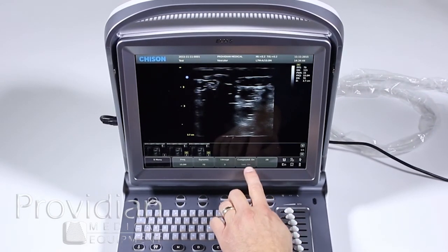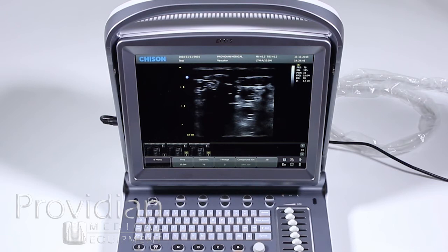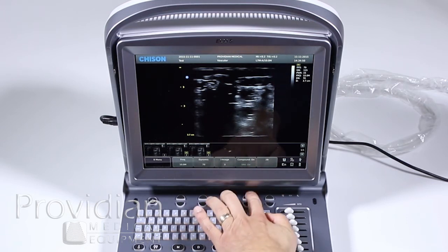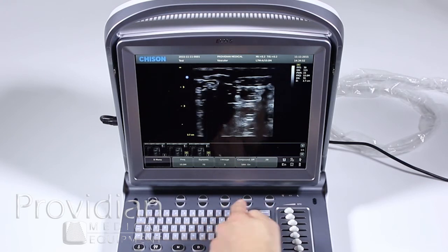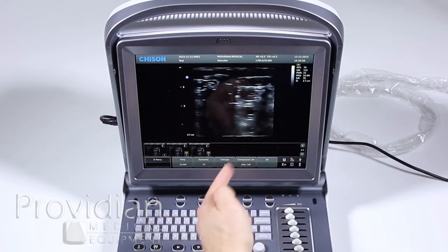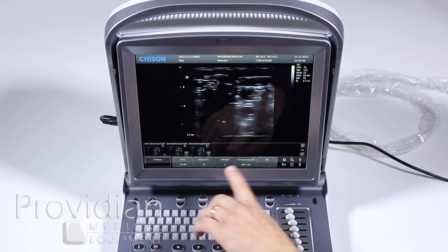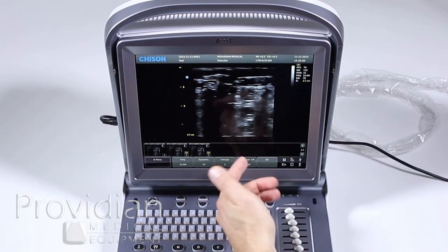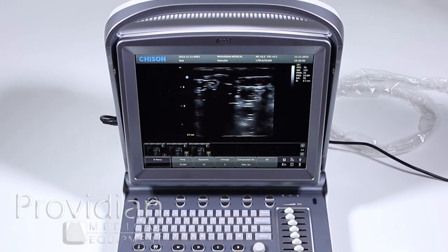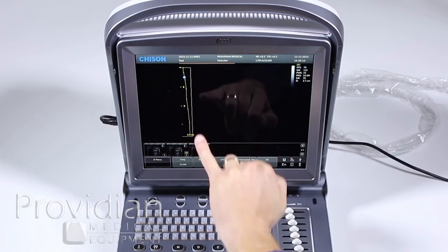Compound imaging is shown here — it's currently on. Below it is speckle reduction imaging. To turn speckle reduction off, you must turn compound off first, then toggle speckle reduction on or off, and then turn compound back on. Any time you want to adjust speckle reduction, you first need to toggle compound off to get it in the setting you want. Compound imaging and speckle reduction are also covered in the image optimization guide.